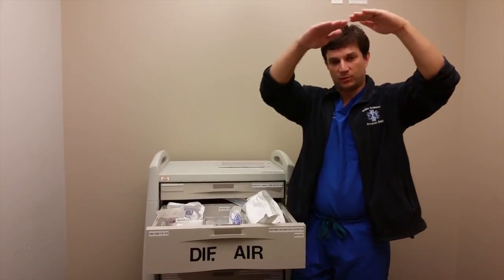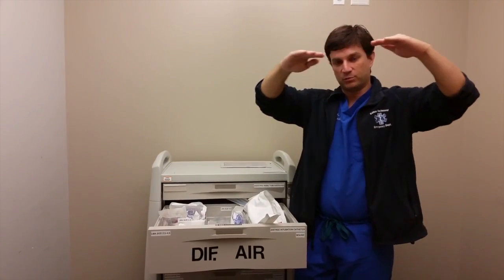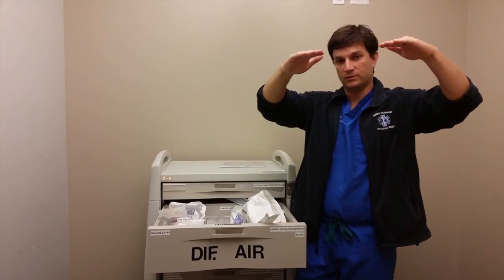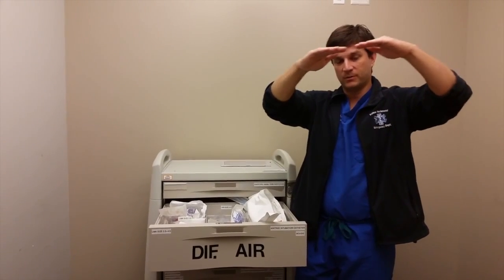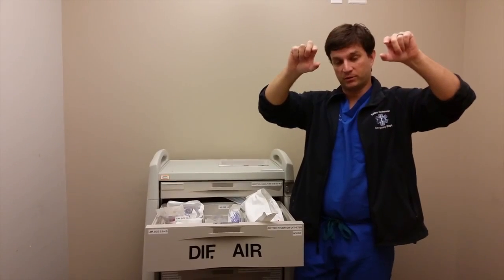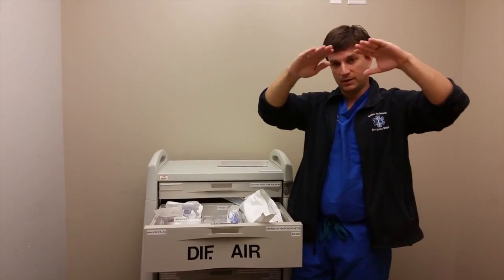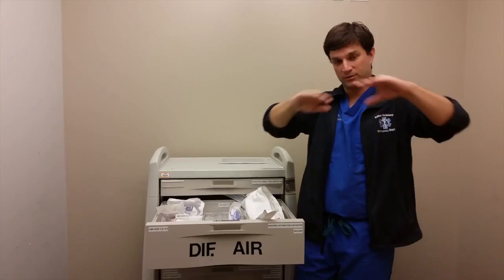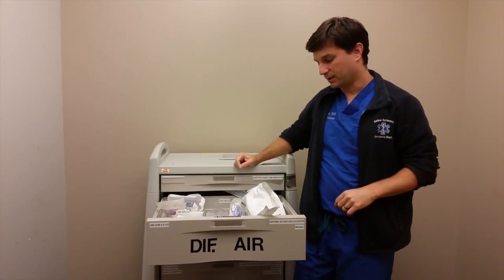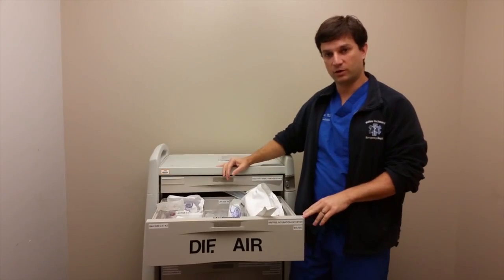When you visualize an algorithm, oftentimes there's a breaking point where you've induced paralysis, you've initiated RSI, rapid sequence induction or intubation. But the induction part's really what I'm talking about, where you've pushed a paralytic. Once you're below that line, your options diverge a little bit, and the urgency becomes very much greater. So that's really where the rest of the cart comes into play.